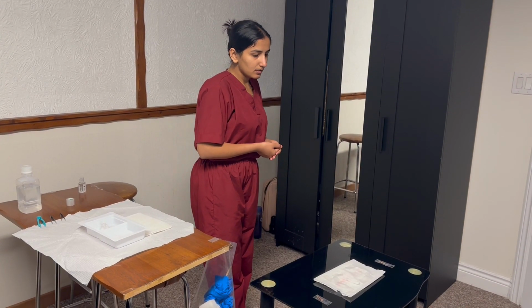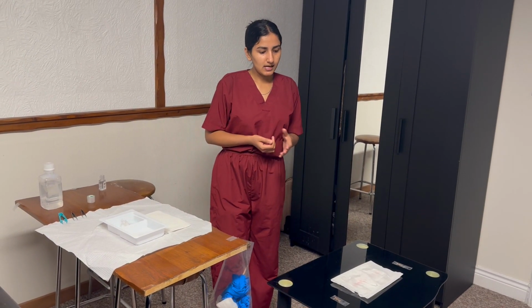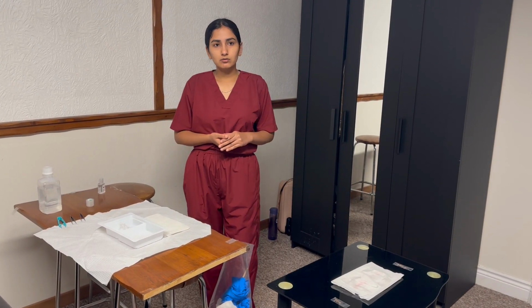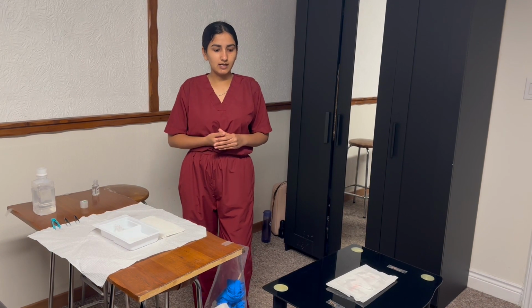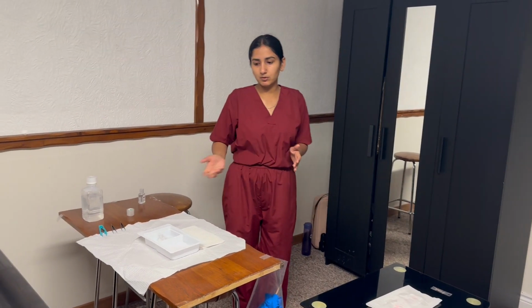And also I will now report the findings regarding the dressing. As I can see, it was serosanguineous fluid, and there was no pus, no odor, and also there was no active bleeding. And regarding the wound assessment, I can see there was a 9 centimeter length, and there was an erythema but no swelling, no edema, no pain, and it was well approximated. I will document these findings and I will provide aftercare.